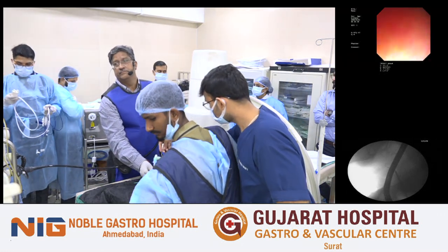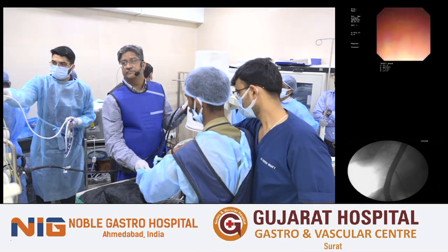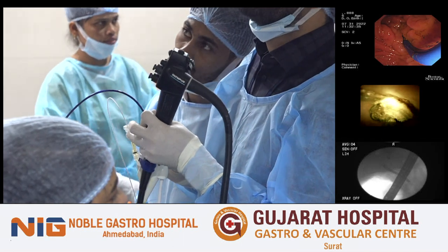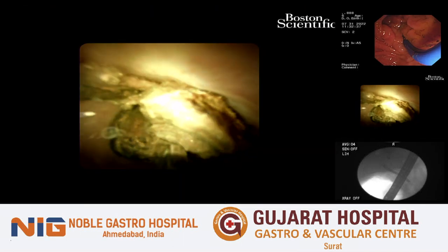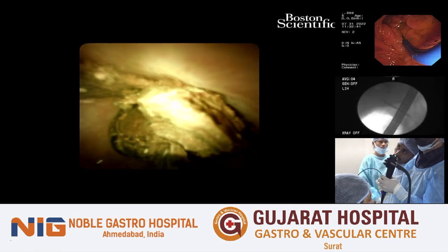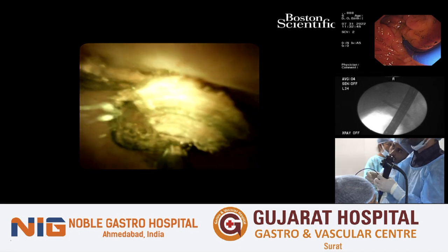Can I show it here? Just sorry to interrupt. You can see those layers over there, isn't it? Can you see the screen? You're still on with us? With you, we are with you. Yeah, you can see the layers of the stone. You can see how nicely it is broken because you can see all the layers there. Okay, that actually gives us satisfaction that we're able to break to the center of the stone.